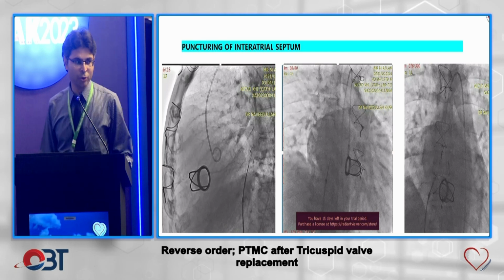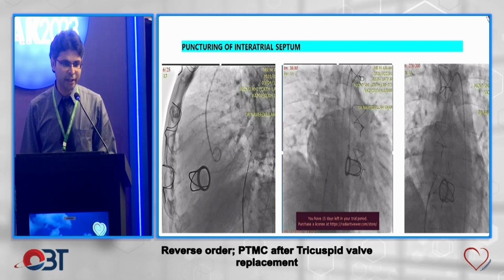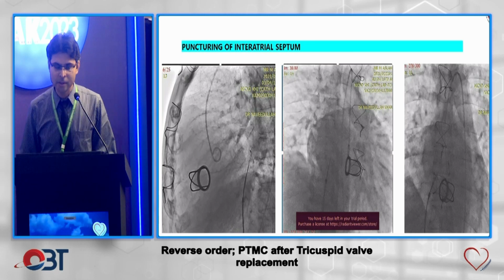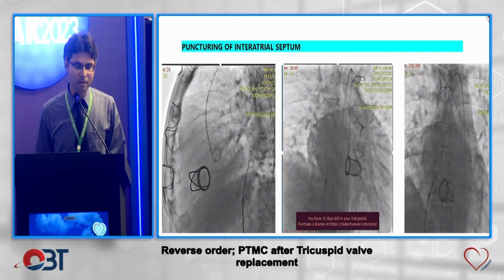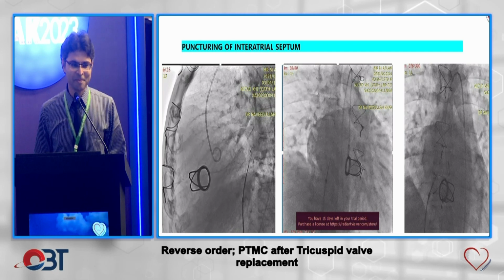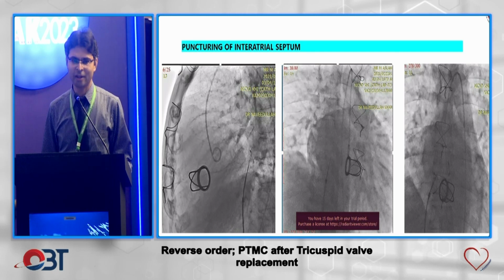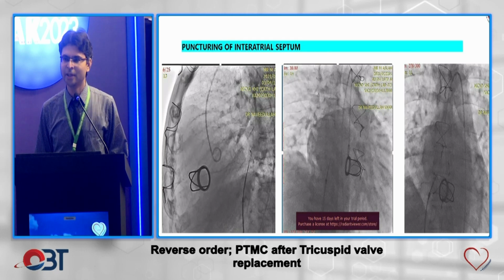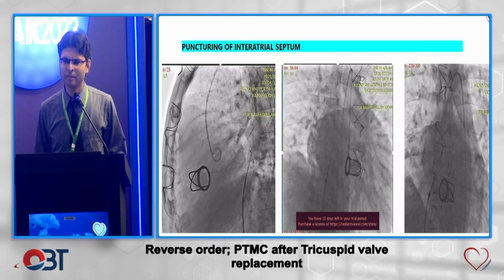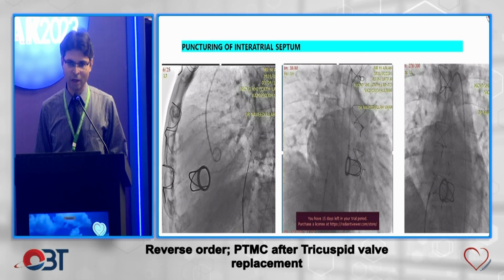So how did we take the RV pressure in that case? Anyone from the audience? How will you take RV pressures? Echo is one method, to find the RV pressure through PR. During the PTMC, how did we take the RV pressure?